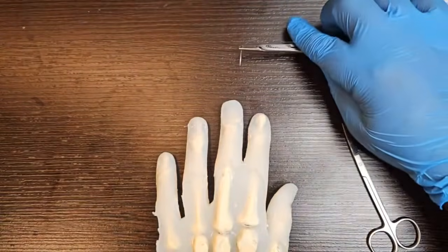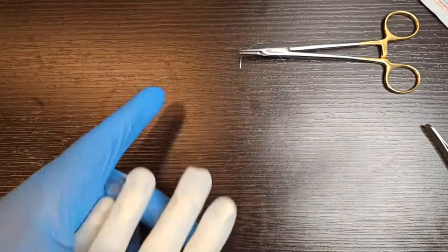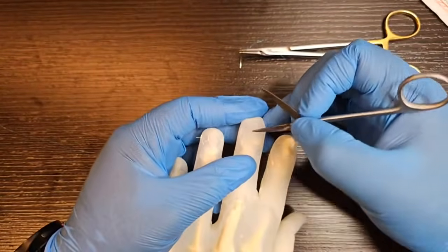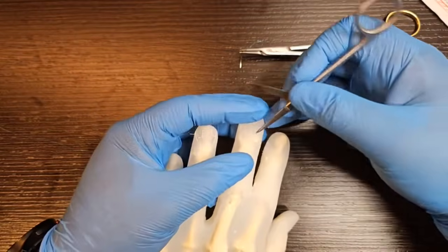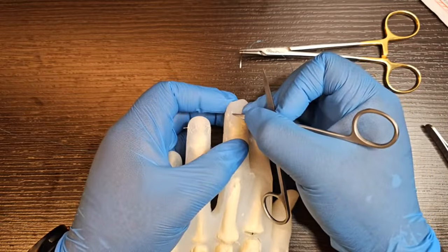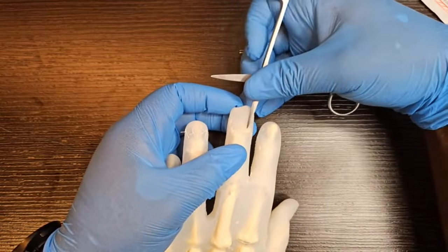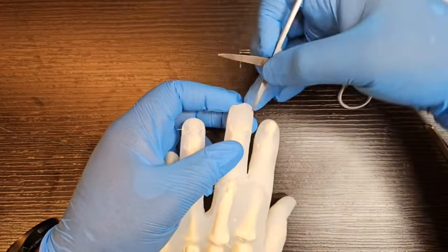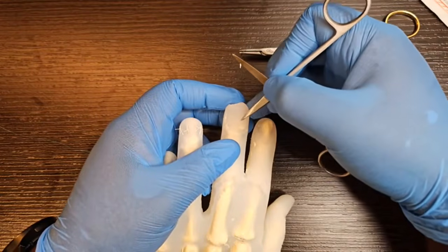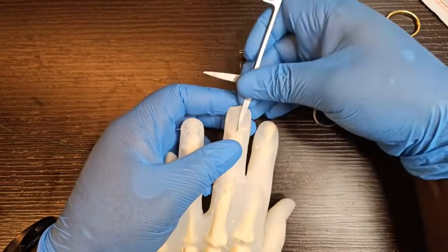So if you still have a nail plate on your fingertip, the first thing you need to do is release the eponychial fold. So the way I do that, many ways to do it. So the eponychial fold and the paronychial fold. On top of the nail, I would get my scissor, or tenotomies ideally, or Mitchell's trimmer, it depends on your set, and push the skin off of the nail plate. It has lots of little attachments that if you just take off the nail straight away, it will take it all with it and ruin the folds of the nail plate. So I go on top of the nail, into the skin, and I flick it off.